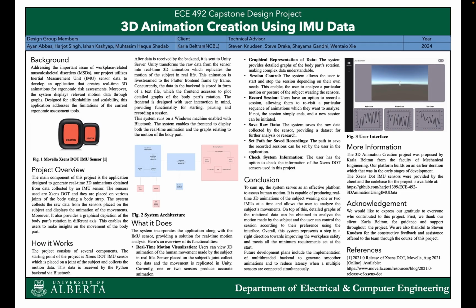Our project tackles the issue of workplace-related musculoskeletal disorders by using inertial measurement units. We have engineered a system capable of rendering real-time 3D animations, closely mirroring the movement made by the subject wearing the sensor, providing a tool for ergonomic risk assessment.